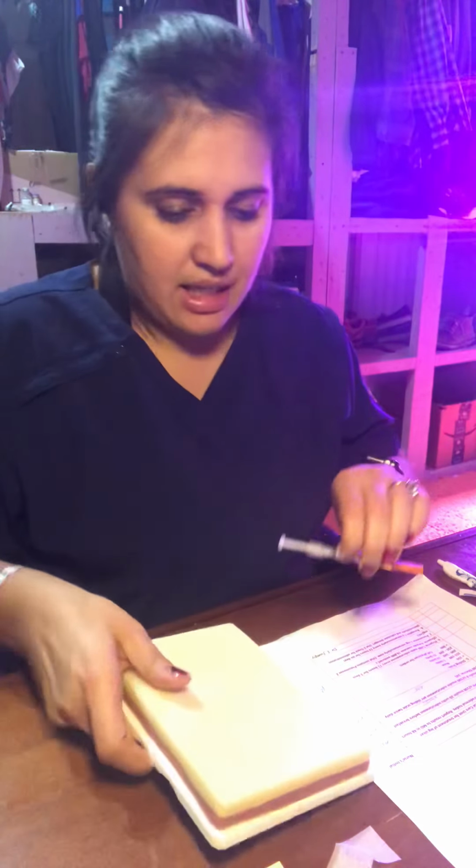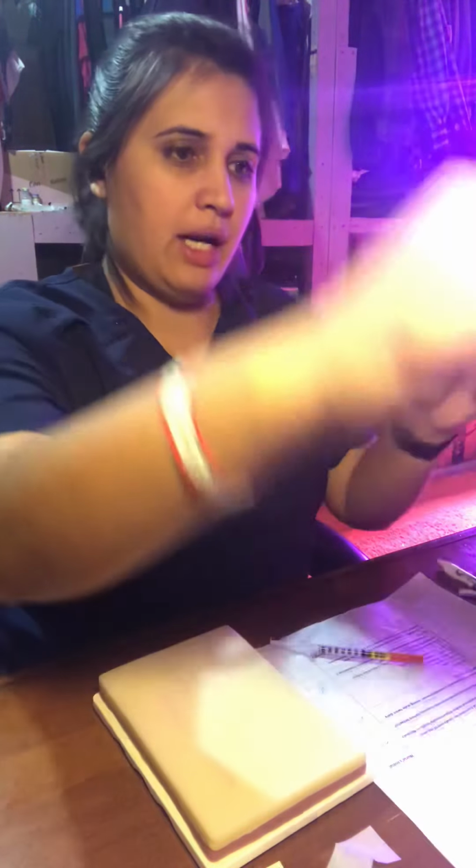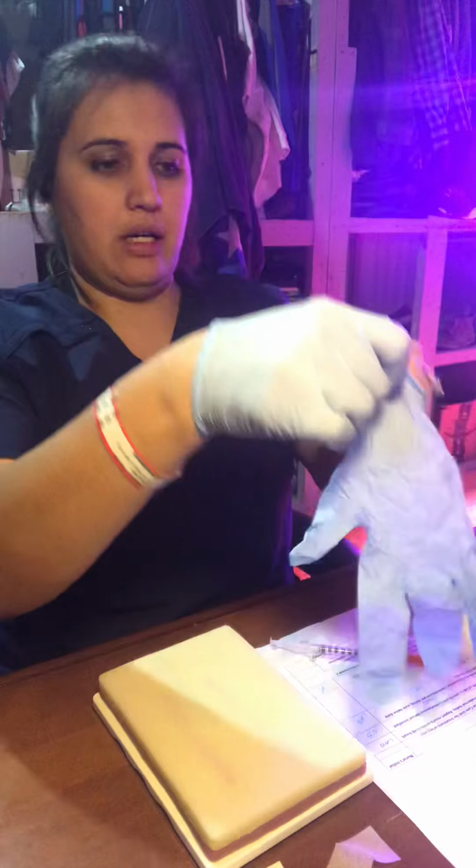Then I pick a site. The sites for insulin are your belly, on the back where your love handles sort of are, and the back of your arm. Now I will put on clean gloves.